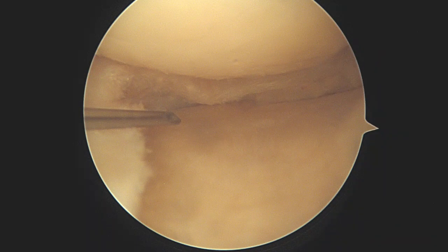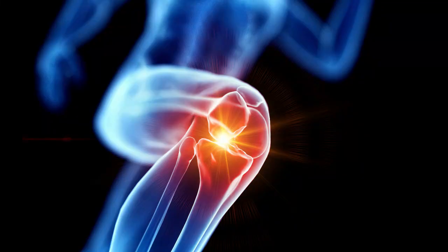And it's easy to perform at the end of our procedure by inserting a needle into the joint and injecting our collagen or hyaluronic acid into the compartment affected by chondropathy. It's just one of the complementary actions we will see in detail in the future that we may apply on our joint in order to prevent the evolution of the degenerative symptomatology and to relieve the clinical consequences of mild osteoarthritis.